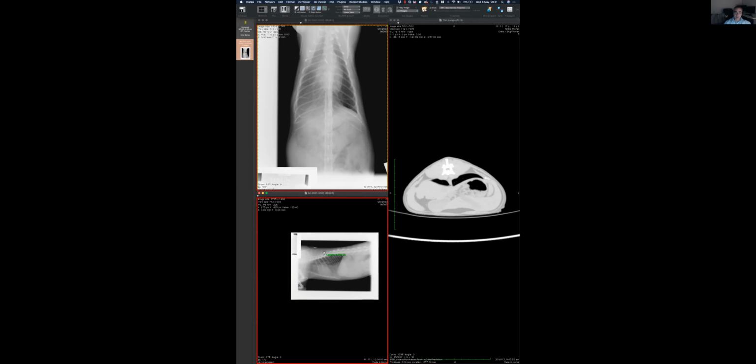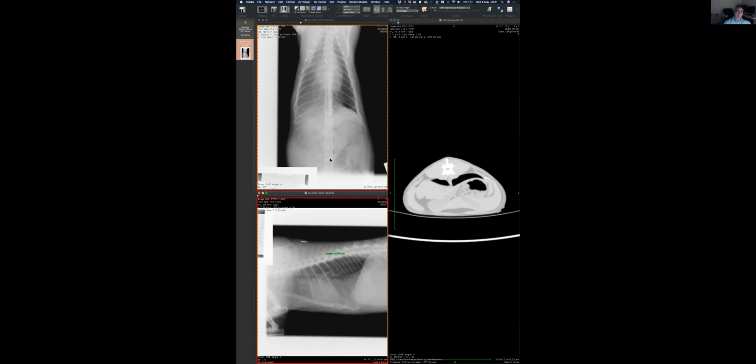Makes sense? Now if we go back to the original images, the thing is that the features are very, very mild. You really need to be hard, you need to be tough, to really go after those findings. They are mild, but there is a mass effect. Makes sense? There is a mass effect. Now there is increased opacity in that hemithorax, and also things are moving away from that hemithorax, moving away caudally, moving away to the left.